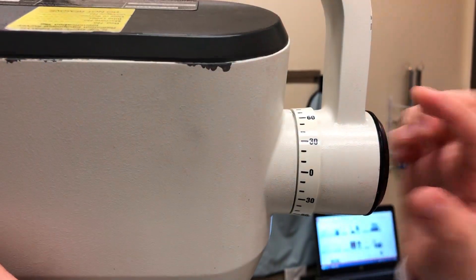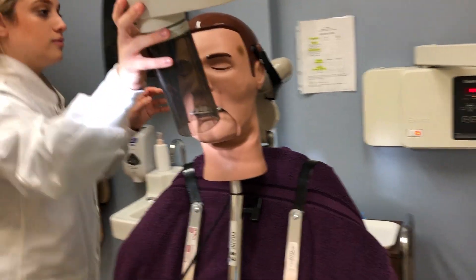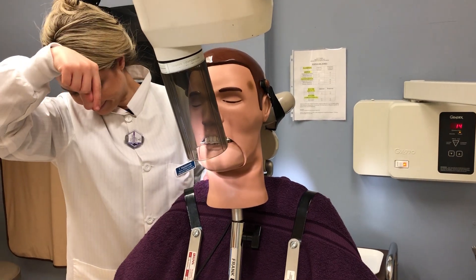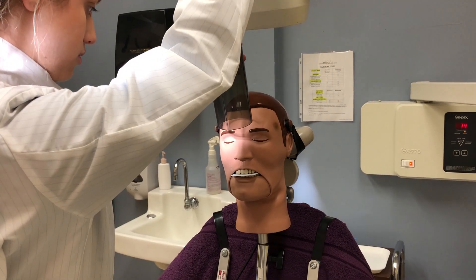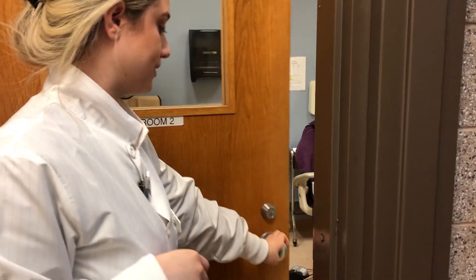Here you see the student touching everything without barriers, but that is okay — we are just demonstrating. So once you have your patient adjusted you can go ahead and expose your patient. Make sure that you do not touch the doors. If this were a real situation, you don't want to touch anything that does not have a barrier.